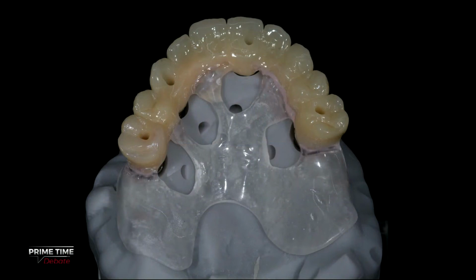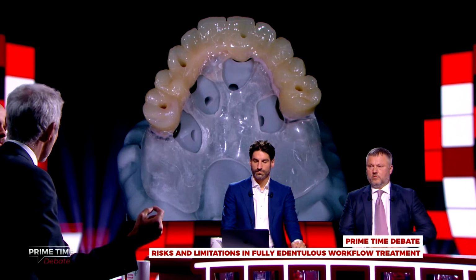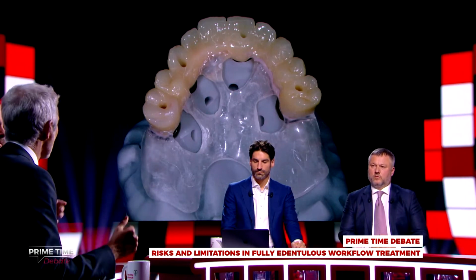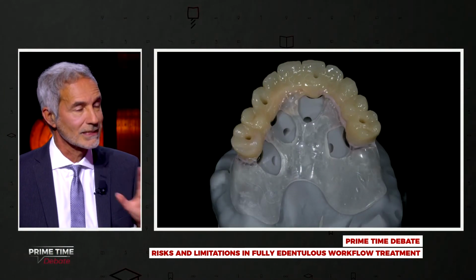And this is the image related to the provisional bridge. We need the rest because we cannot afford to have the stabilization only of the occlusion, so you can link the bridge to the fixation pin if you want, or you can more simply have a rest on the palate in order to have a stable position.